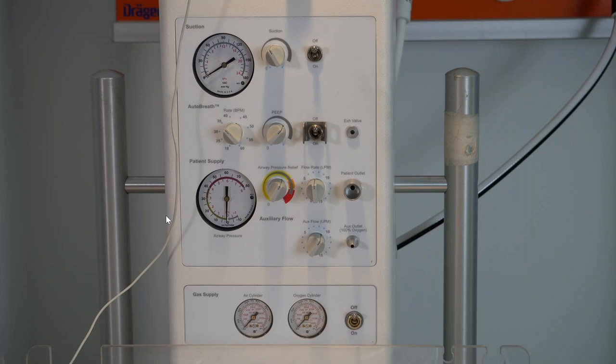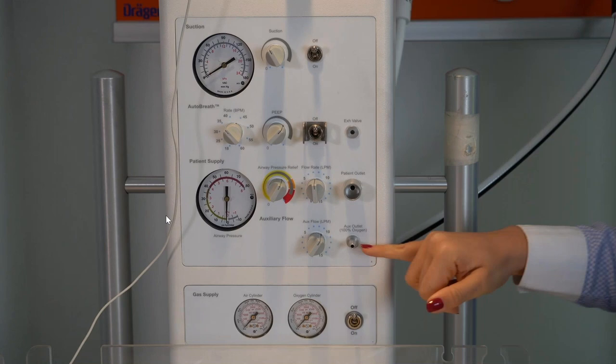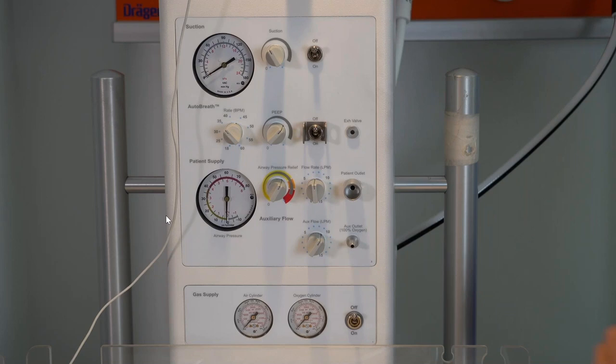We have one more question. Can we use auxiliary outlets for delivering free flow oxygen to the baby with oxygen hood therapy? I think we have to be mindful, and Linda, you can comment on the overall oxygen hood therapy, whether it's still practiced and how. But here we need to remember that the connection of the outlet might not allow you to connect the oxygen hood in order to perform the oxygen therapy, but you could potentially try to do that.